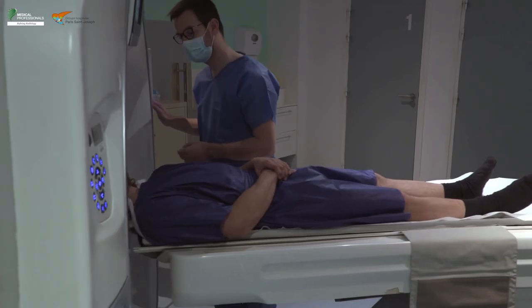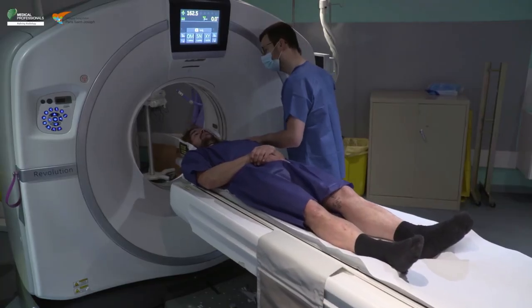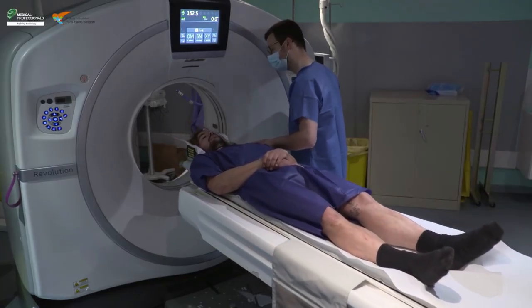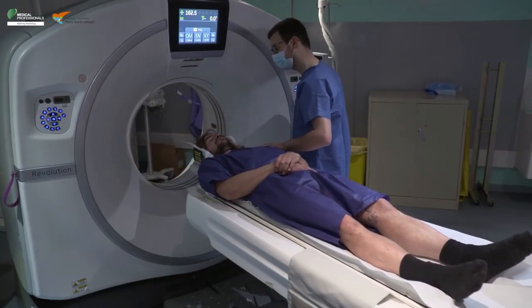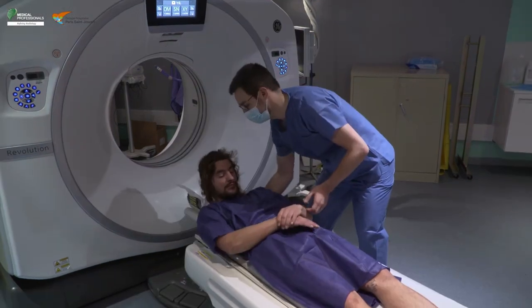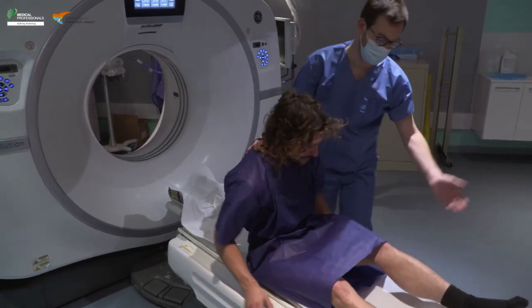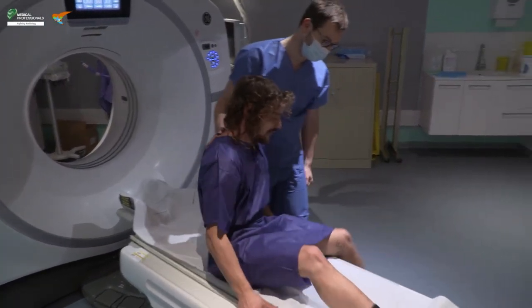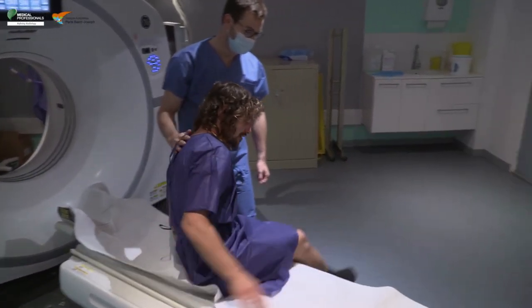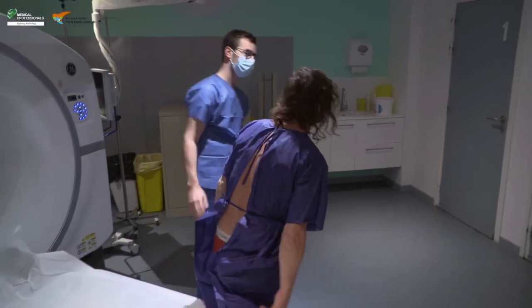At the end of the examination, accompany the patient back to the changing room and tell them they can get dressed. Provide the patient with any post-examination instructions as indicated at your facility.